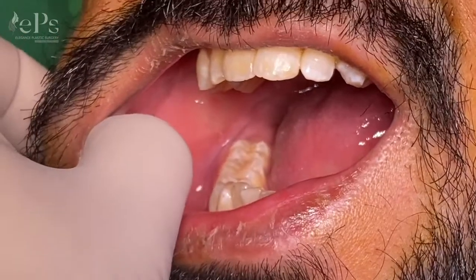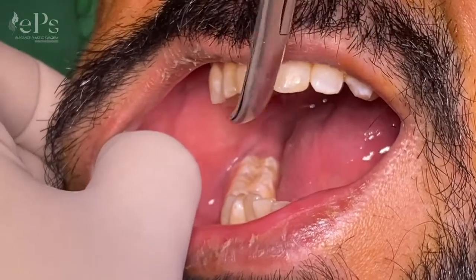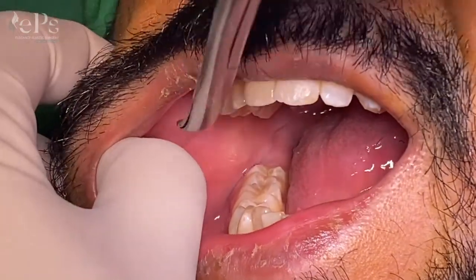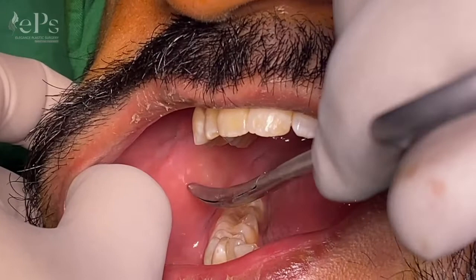The tip of the day is where to give the cut for buccal fat removal. You can see there's a white mucosal line which forms when we close our molars, and this is the Stensen's duct. So between this Stensen's duct and the white line, you can get the incision.